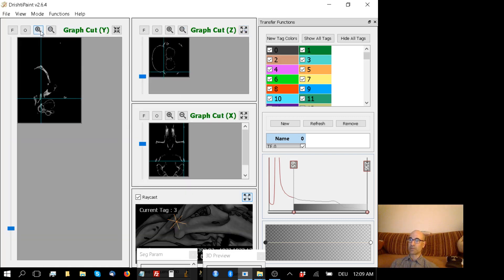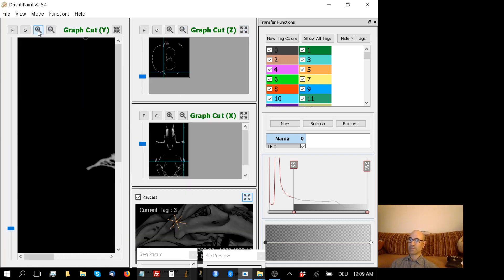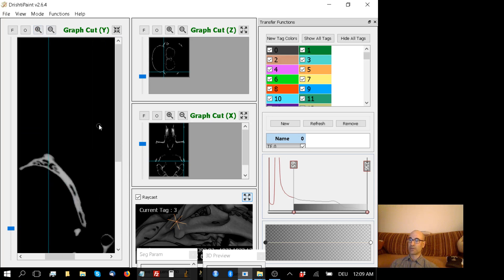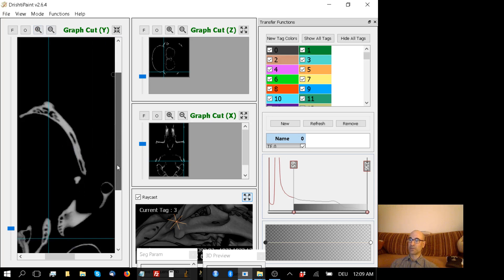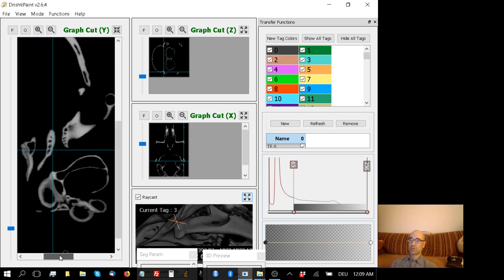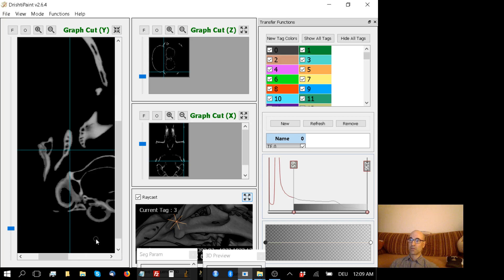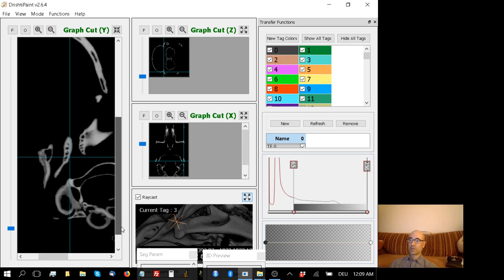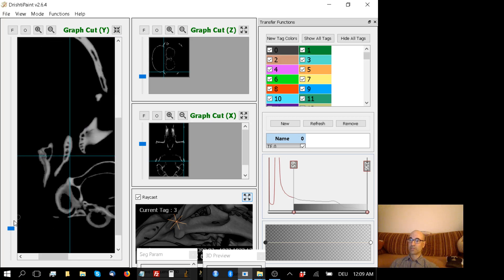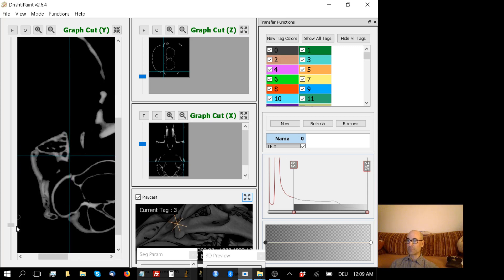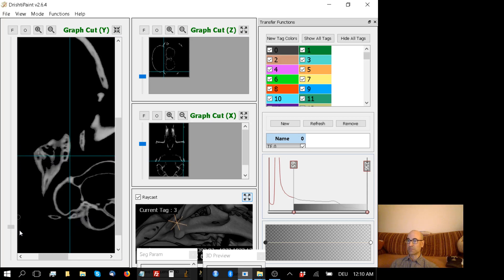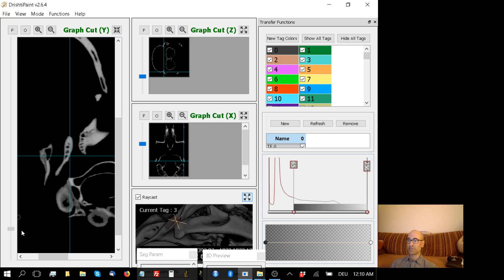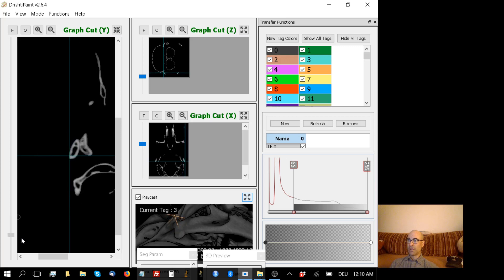So let's go to my Y slice, and I want to magnify this a little bit. I just clicked on that magnifying glass, and now I'm going to use these scroll sliders. The slider on the left side will let you flip through the different 2D images in the Y dimension. And here is the point of contact, right there.